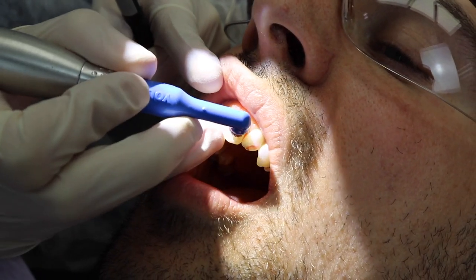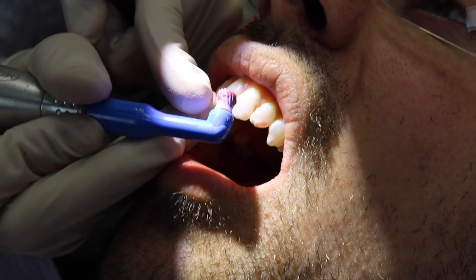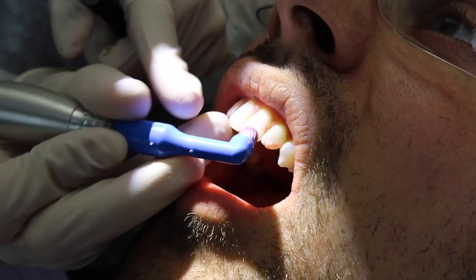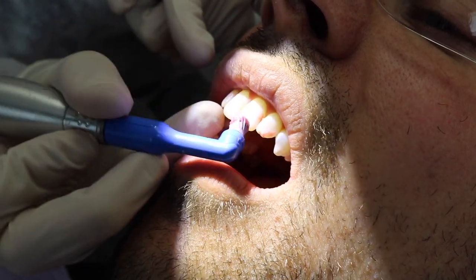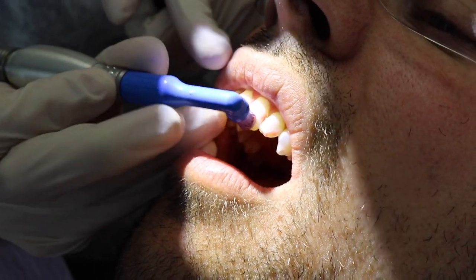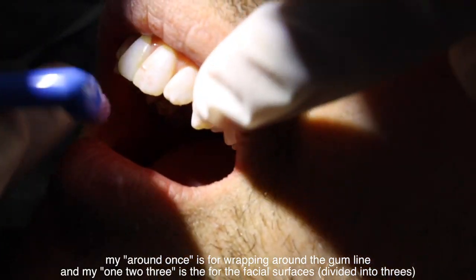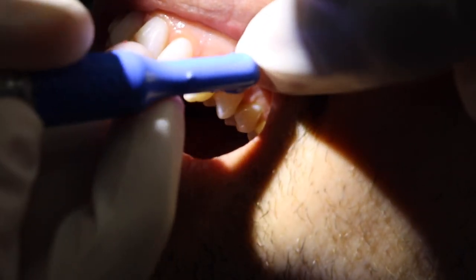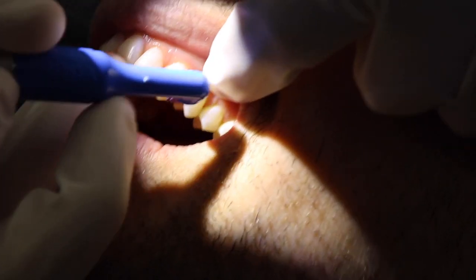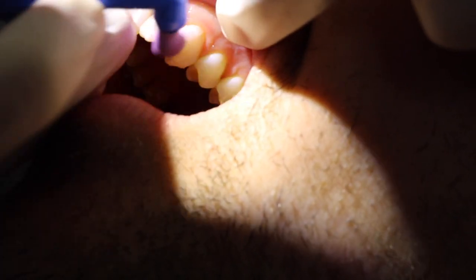I wipe it on and then just go. I'm sure you learn in school — you're supposed to use the outside, flaring the cup. You're not pressing down; that's not doing anything. You're using the sides of the cup, flaring it. So I go around once and then I do one, two, three. Get right up there by the gum line — one, two, three. See how there's not even that much paste?